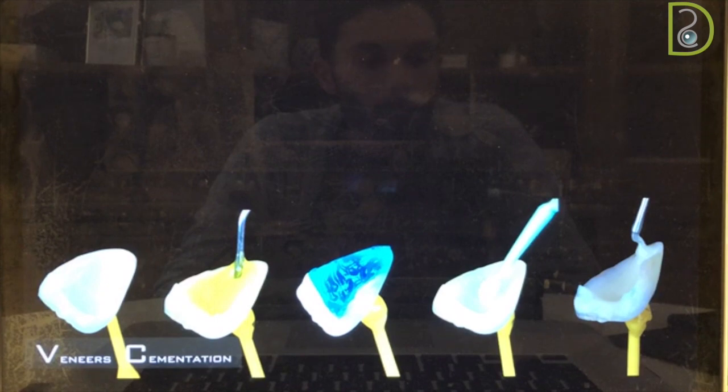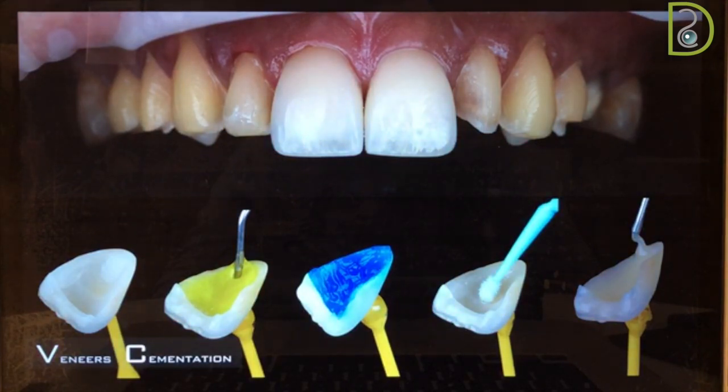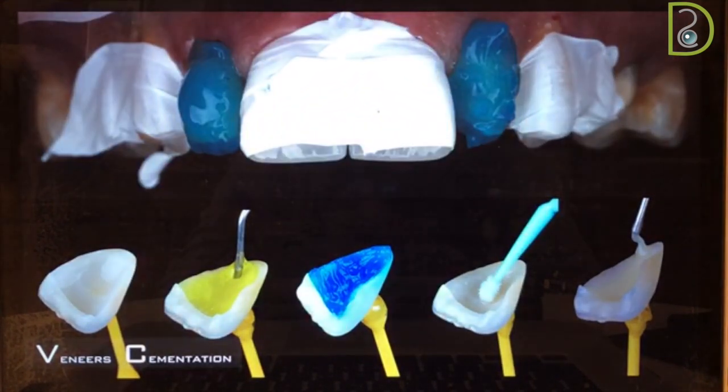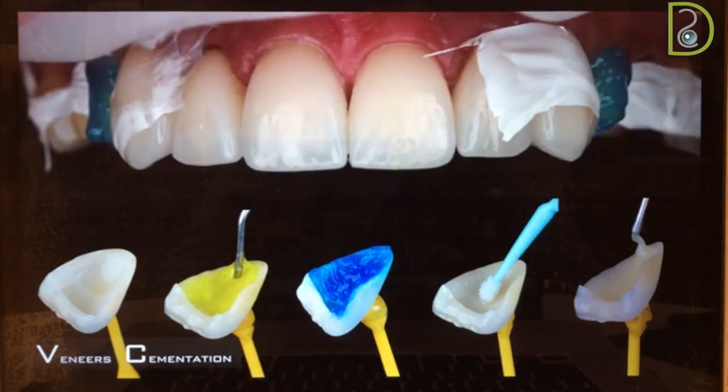So these are the steps. As we said, rule number 1: light cure resin cement for veneers, because they're higher in color stability than dual cure. Don't use the self-etch adhesive. Rule number 2, which I always recommend and should be rule number 1, please guys, read the instructions.